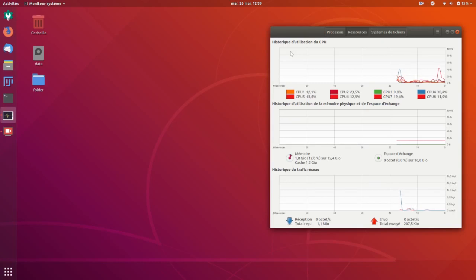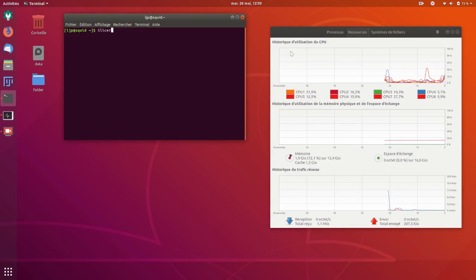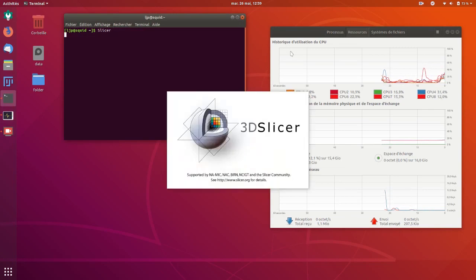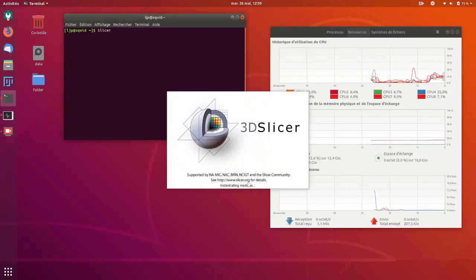Hello, today I'm going to show you how to do landmark registration on 3D Slicer that you can download from the slicer.org website.